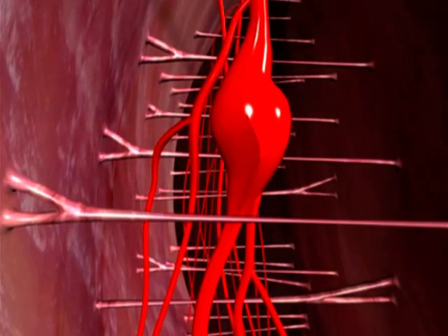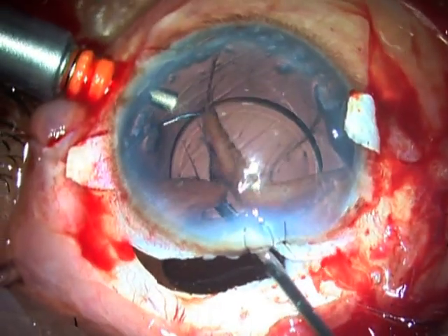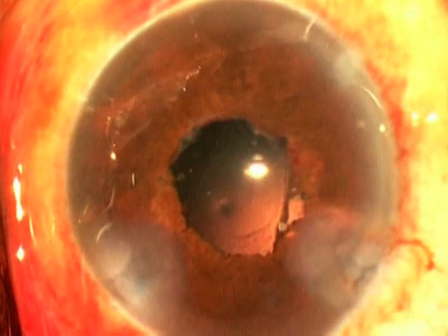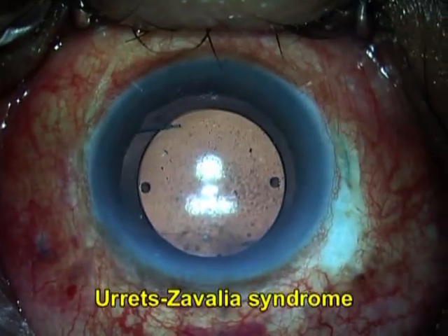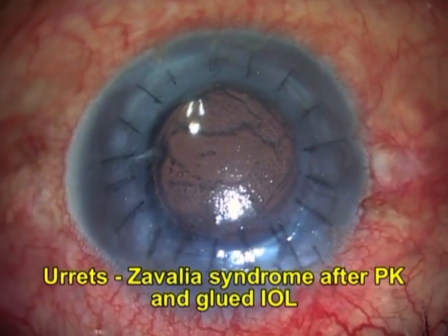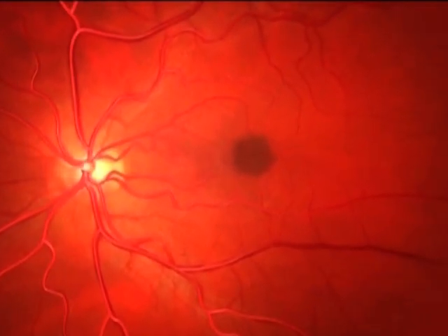Complications that can occur in this procedure are intraocular hemorrhage after iris damage. If the eye is phakic, cataract can form. Iridodialysis and iatrogenic iris damage can occur in atrophic cases. This is just the beginning. A lot needs to be done to ensure the safety and benefits of the procedure in a larger cohort.